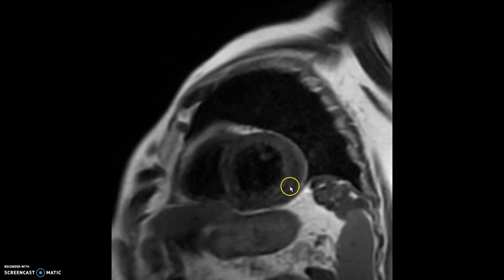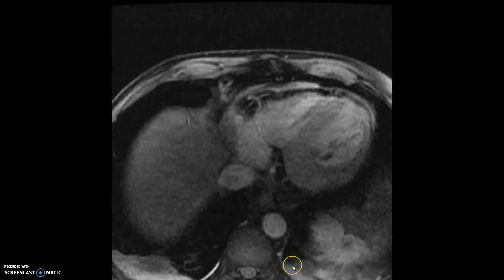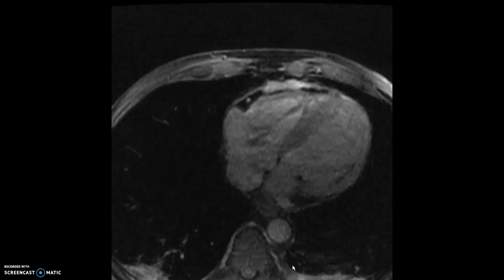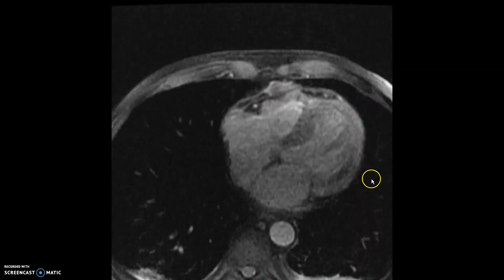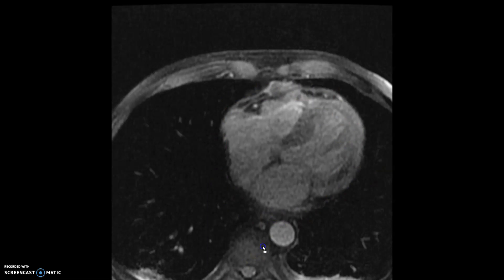After that, we got T2 maps. The T2 maps also showed very elevated numbers, somewhere above 80, which are definitive for myocardial edema. Looking at this LAVA imaging, which is a T1 fat-sat imaging, you can see the whole pericardium lighting up here, indicating acute pericarditis going on as well.